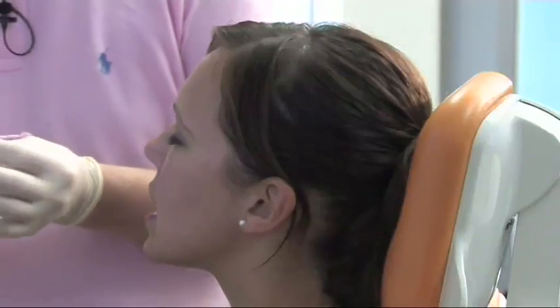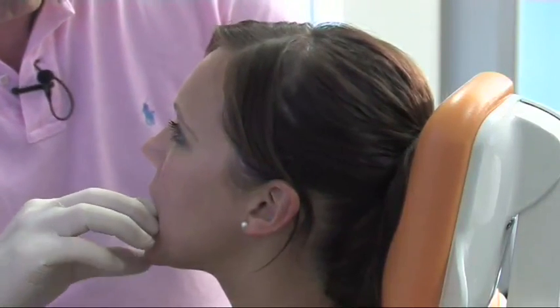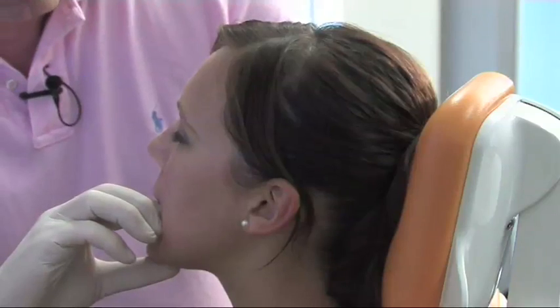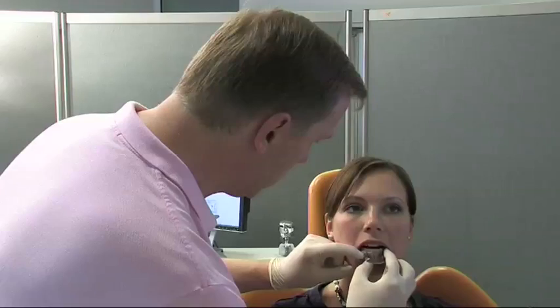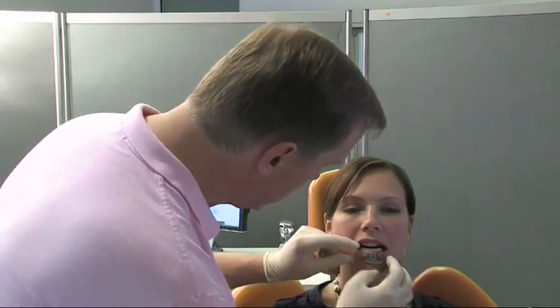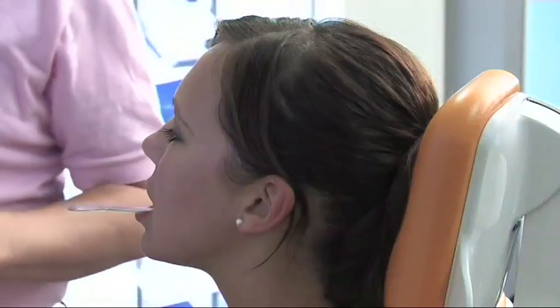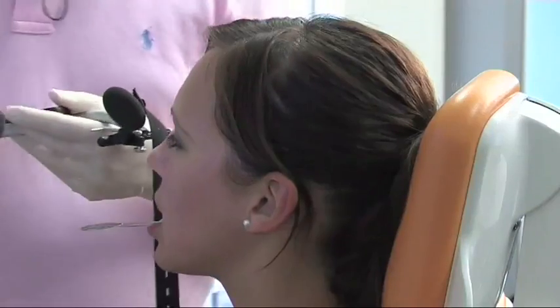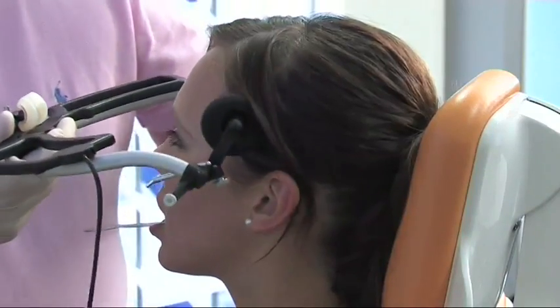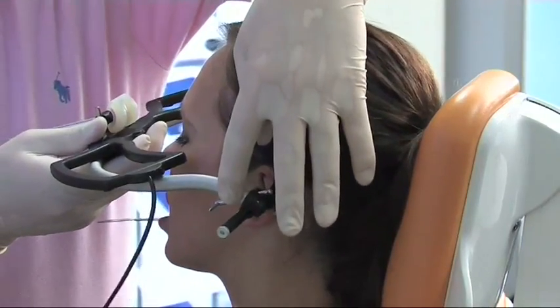First of all, this bow is positioned on the teeth in the lower jaw. Don't be afraid. Is that okay? Good. Now you can help me a little. Please hold this on this side.